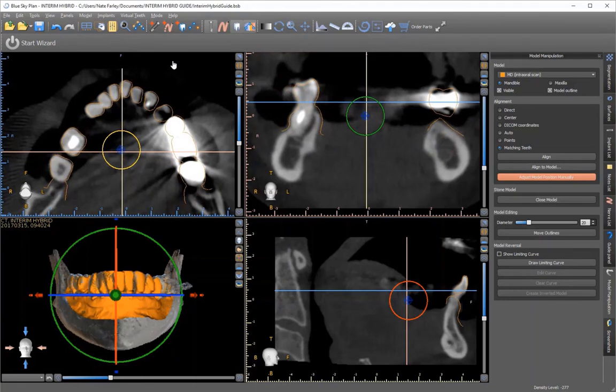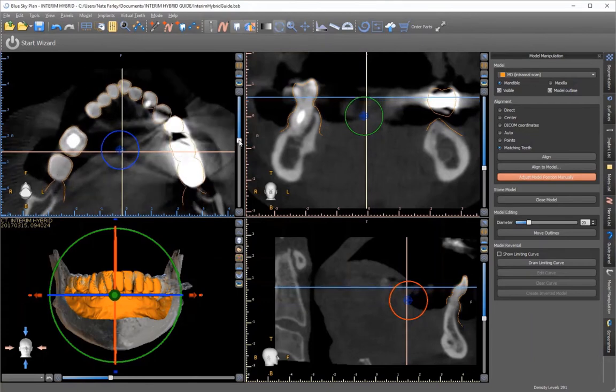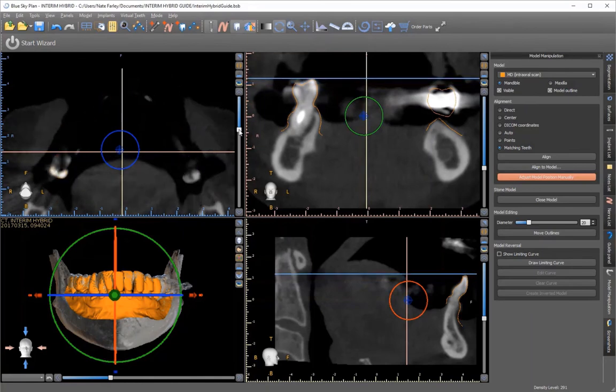If you see that something is off just a little bit, either you've got to rotate something or move the whole entire STL file along that plane until everything starts to align.